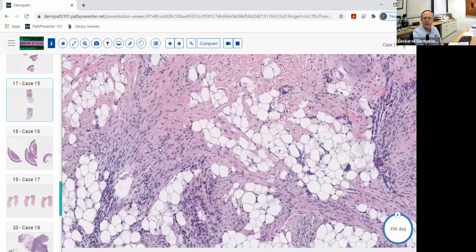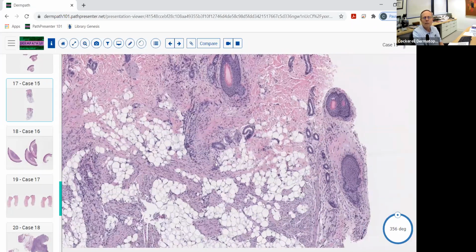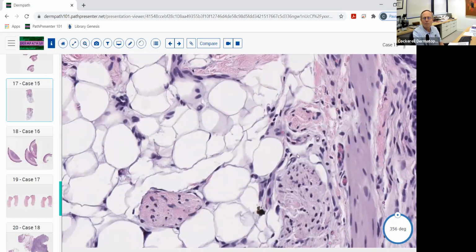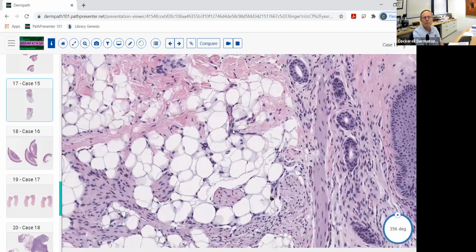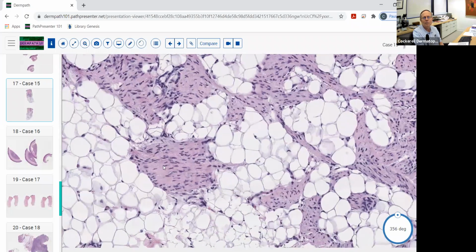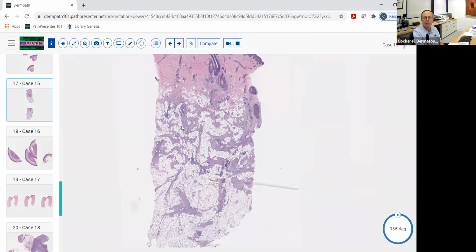It's not DFSP. It doesn't look anything like dermatofibrosarcoma protuberans. It's not smooth muscle. These cells are really fibroblasts. They've got these blunt cigar-shaped nuclei. They don't have the delicate S-shaped spindle-shaped nuclei of a neural lesion. They don't have the angulated, jagged, bizarre features of, say, a histiocyte. These are really more fibroblasts that are forming these small aggregations of collagen and fibroblasts here. So fibrous hamartoma of infancy. In that case, it's a nice, beautiful example of that.